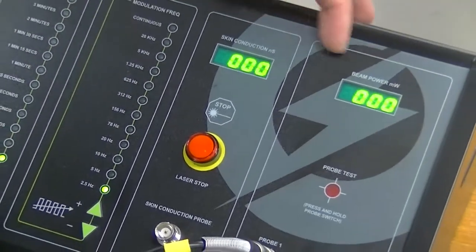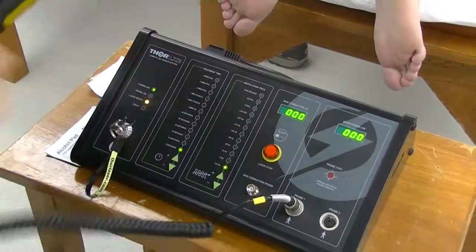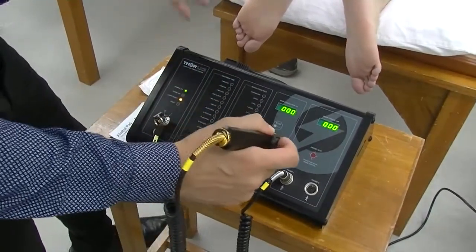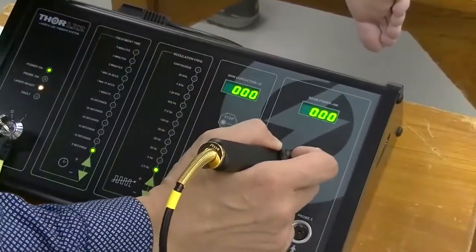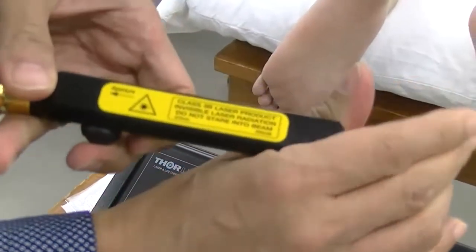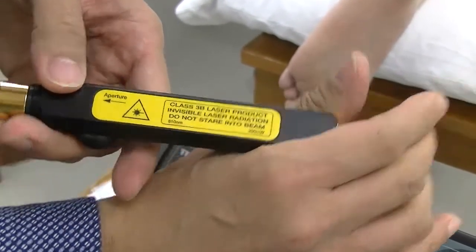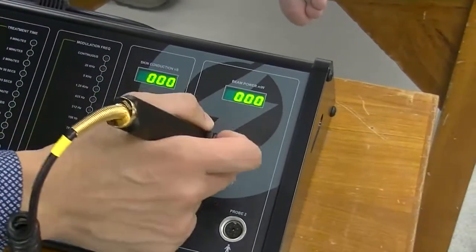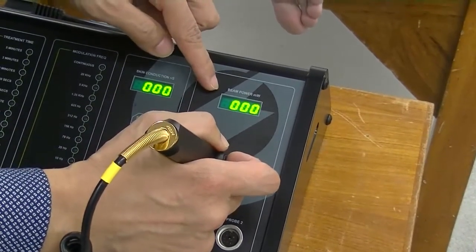Another panel provides a digital display to show the testing region, which is used to test the probe. Whenever we turn on the machine and position the patient, we must test the machine before treatment. This probe is rated at around 0.2 watts, or 200 milliwatts. We press the button to verify — the reading shows around 200 — confirming it is working. Then press again to stop.